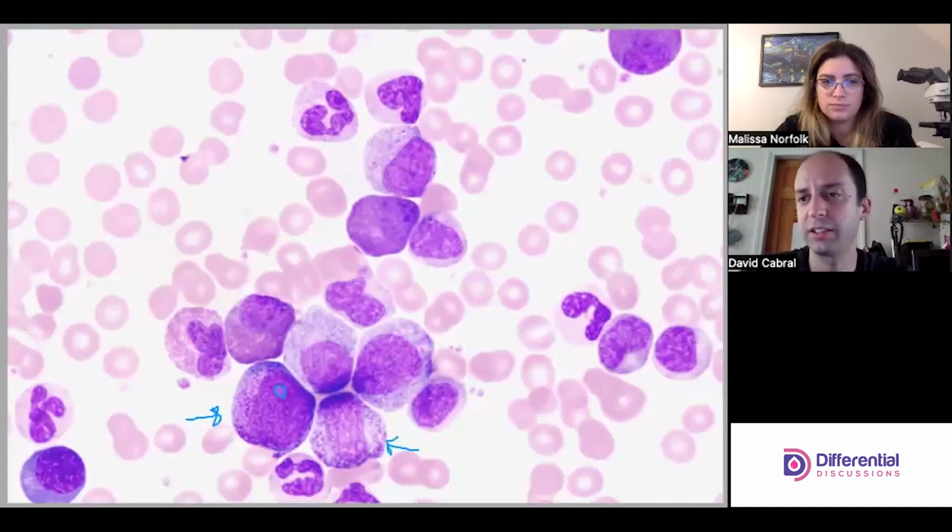Okay. And then in that case, class, what would we do? I would go with a meta. We round up, right? Exactly. We always round up. We'll go meta on that one. Okay. Let me clear those arrows.